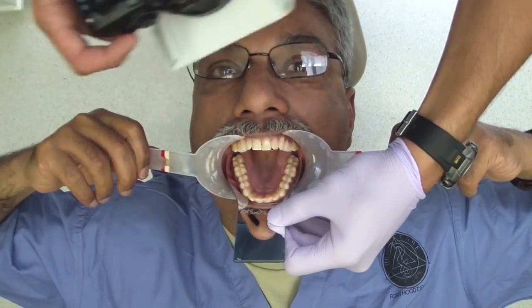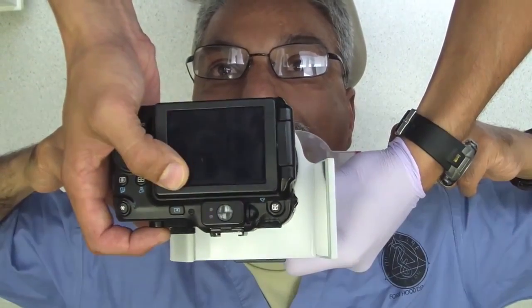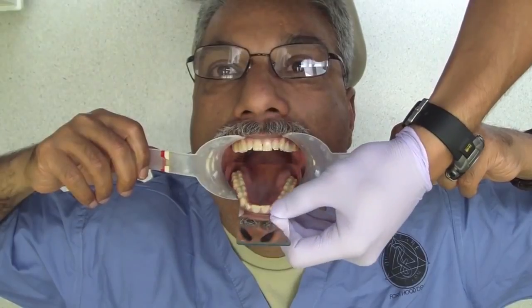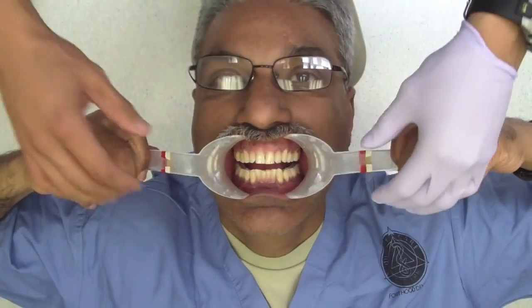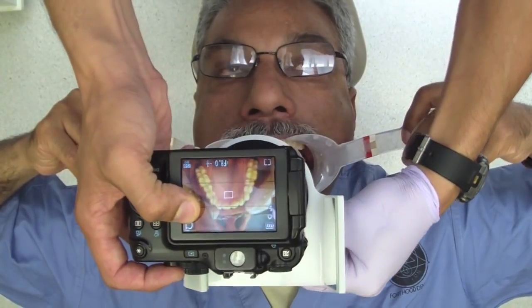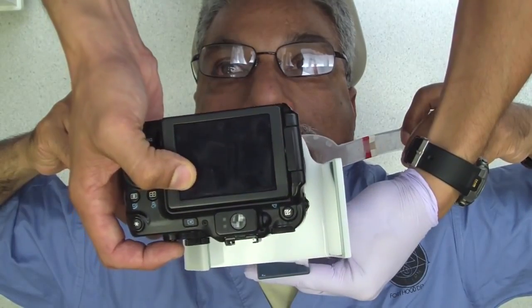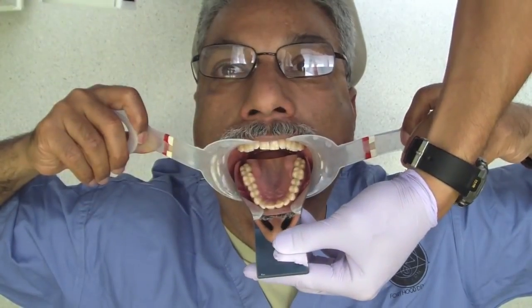The key is to make sure that you see everything without the lips. Sometimes if you have an edentulous portion on the anterior, one of the tricks you can do is have the patient hang on to the retractors and keep them like a smile, so it automatically gets them to pull the cheeks and lip superiorly. So again, we'll take another photo here, trying to make sure that I grab all of the teeth.